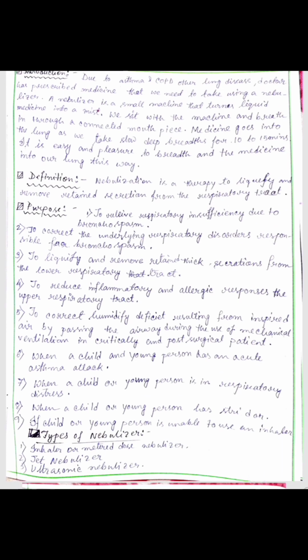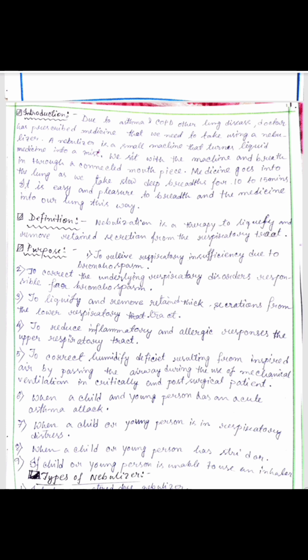Next, see the definition. Nebulization is a therapy to liquefy and remove retained secretion from the respiratory tract. Then this is the purpose: to relieve respiratory insufficiency due to bronchospasm, to correct the underlying respiratory disorders responsible for bronchospasm, to liquefy and remove thick secretions from the lower respiratory tract.